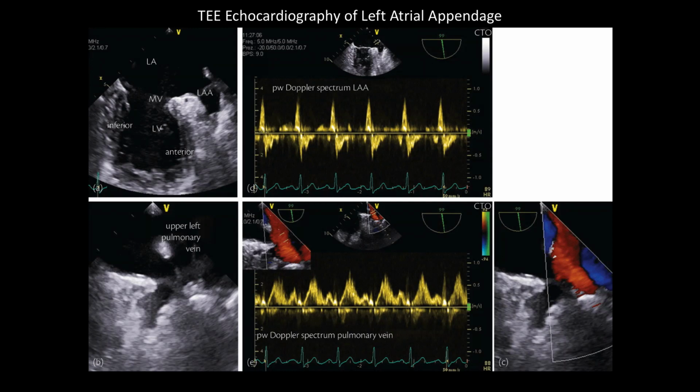And so it's a really important call. We can talk about resolution and time resolution and everything. This all boils down to false positive, false negative of, is there a thrombus in there, right? A false negative, if we miss a thrombus in there, it's a big deal. And we can talk on that.